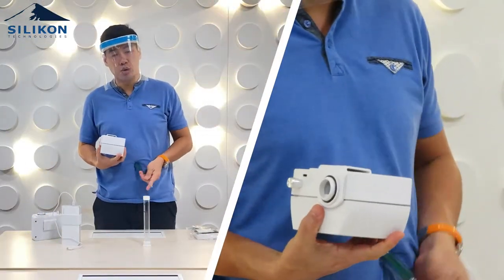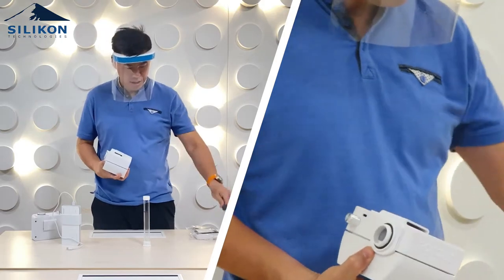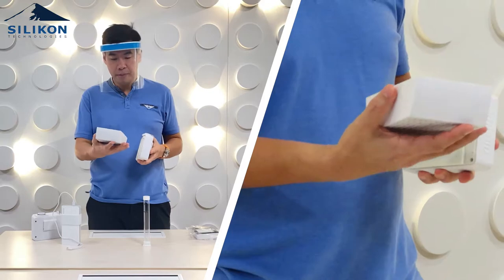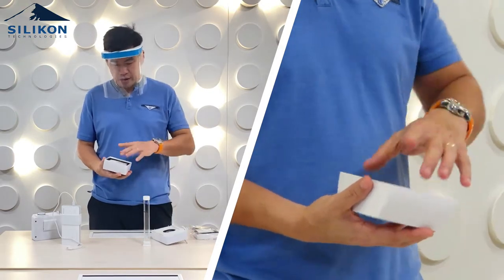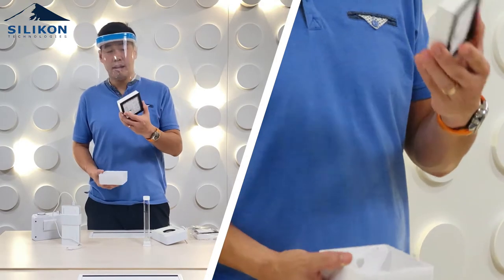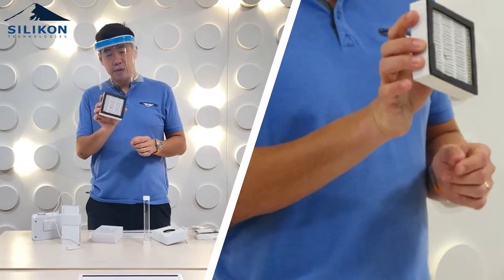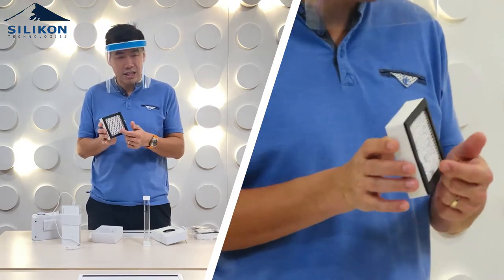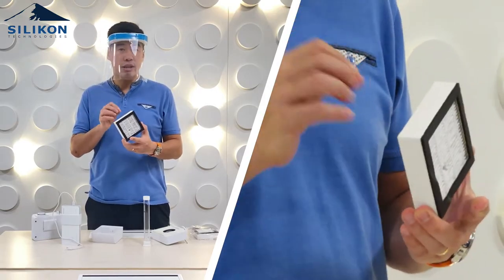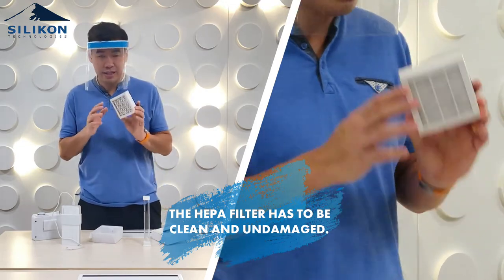Assuming we've already unscrewed the screws at the back, you just open the filter cover and remove the dirty or damaged HEPA filter. If you see scratches or damage to it, then you really have to replace it — it means air can actually flow in, so it has to be clean and undamaged.